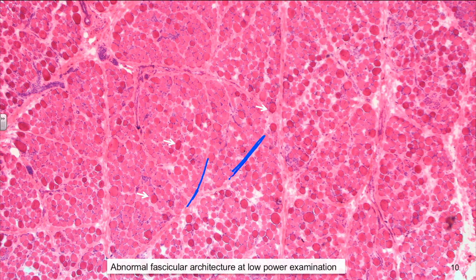So in your examination, using what we said so far, comparing to the normal, we have increased connective scar tissue in the perimysium surrounding the fascicles, and of course in the endomysium around the individual myofibers. You see that the myofibers are very small, and the arrows point to hyalinized or hypercontracted fibers. Many of these fibers have internal nucleation, and maybe here and there we can see split fibers, maybe not at this magnification.